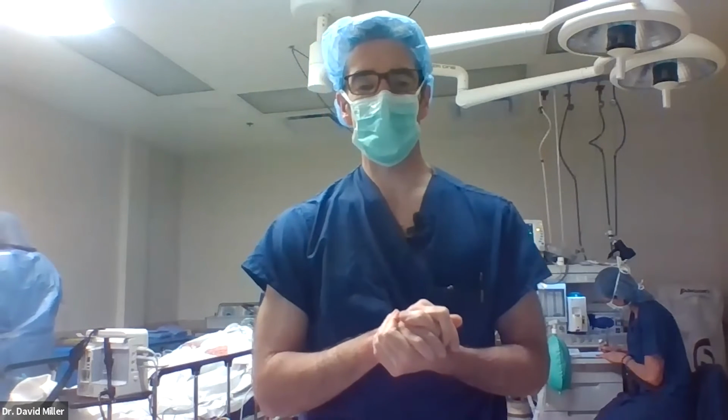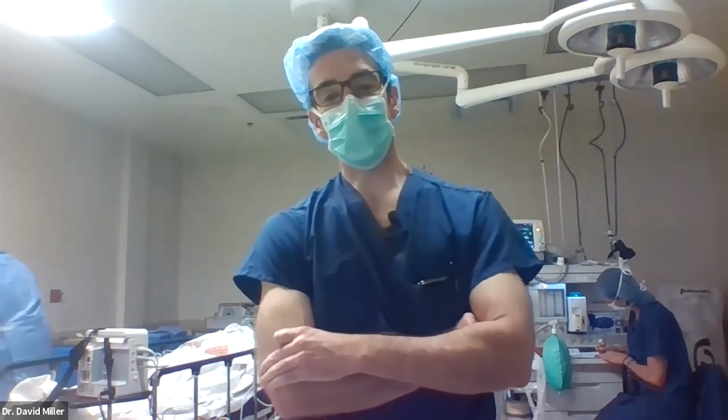Prefer not to use oil because you have to come back and get it out. Oil is always a little more complicated. There's always little oil bubbles left behind. It can cause elevated eye pressure. It can emulsify. It can cause a chronic or smoldering uveitis. So I prefer not to use oil. The gas is much nicer. Sometimes I have used oil for people traveling, business trips they cannot avoid or some other function. And if they were flying, oil is tolerated for airplane flights and gas is not. So it does have a role, but I try to stay with the gas.